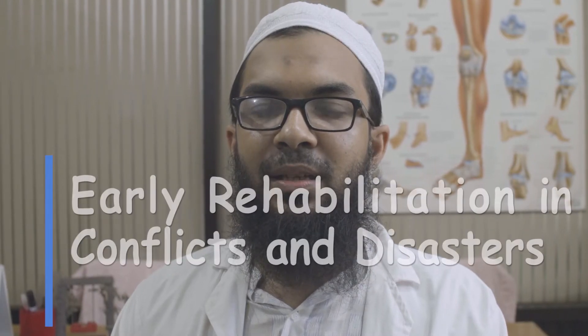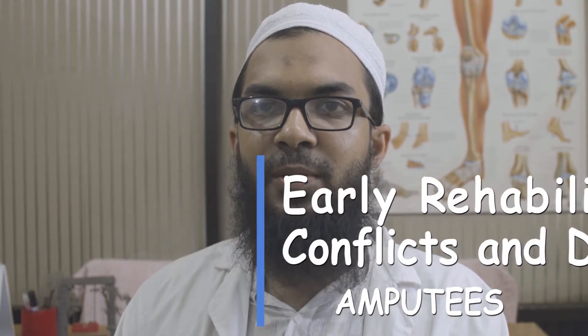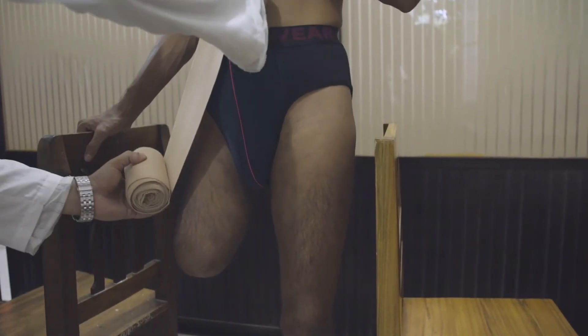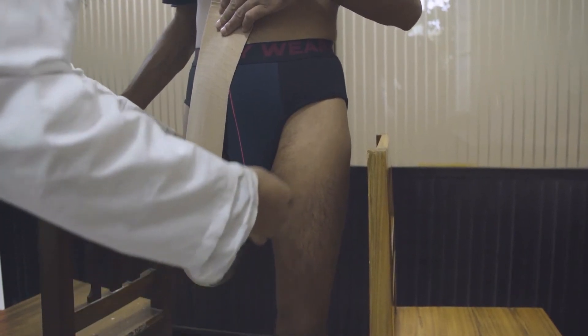I will show you the bandaging. There are two types of bandaging: one is transtibial and one is transfemoral. Bandaging is very important for shaping of the stump, good circulation, and skin protection.